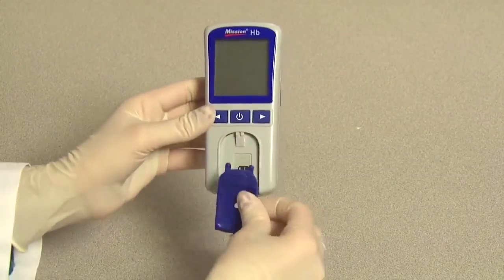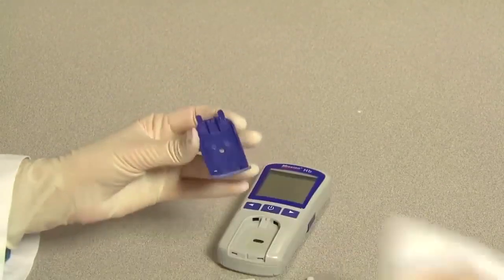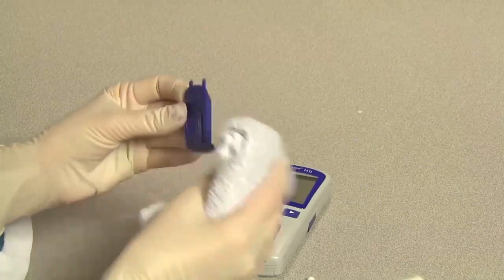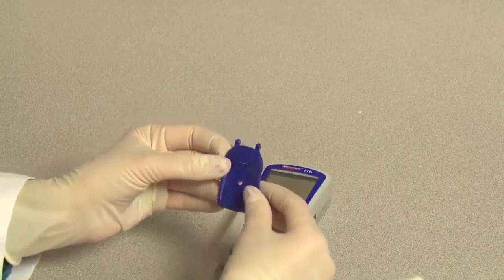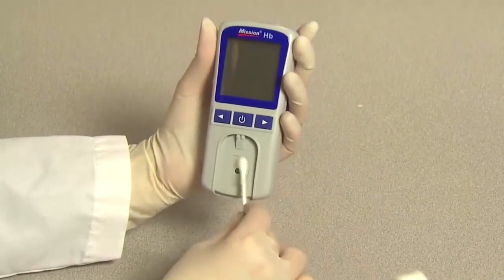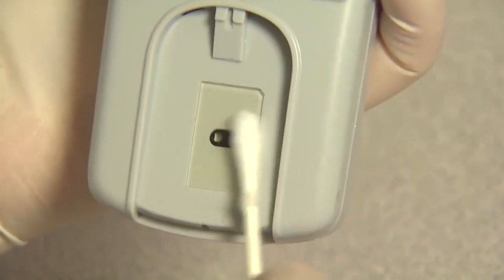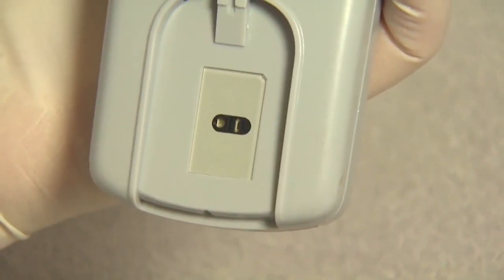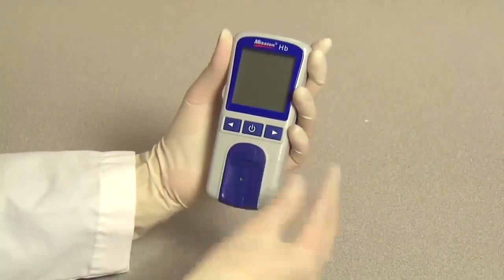Remove the test strip holder by pressing in on the middle of the test strip holder and sliding it out from the meter. Wipe it down with a damp cloth or a mild detergent and dry it with a dry soft cloth. Wipe down the meter sensor area with a cotton swab. Make sure you do not scratch the transparent window covering the sensors. Slide the test strip holder back into the meter.